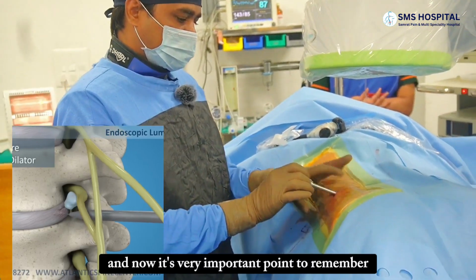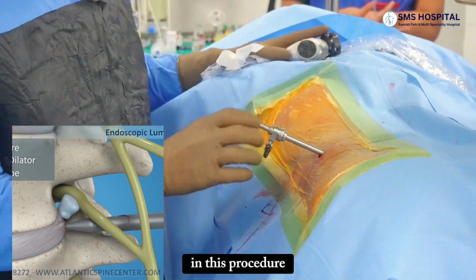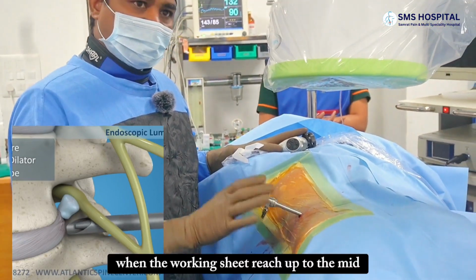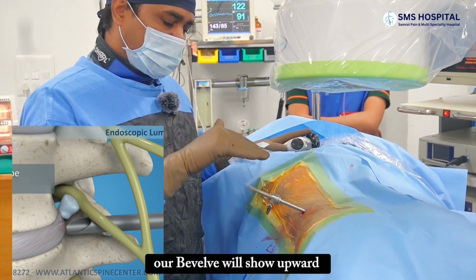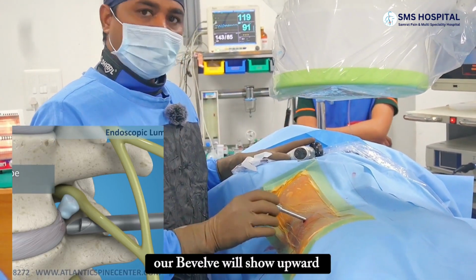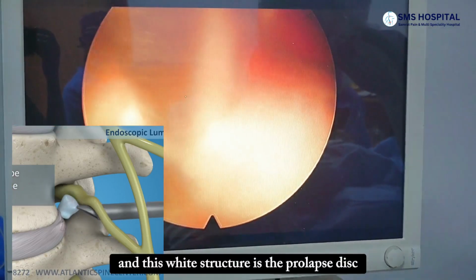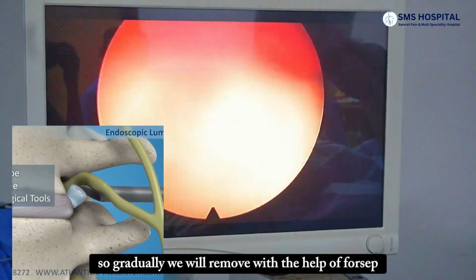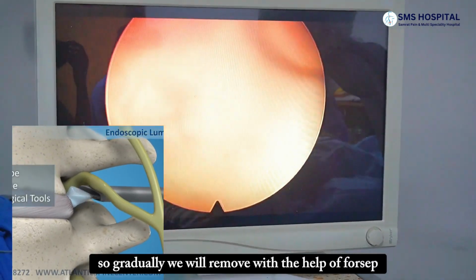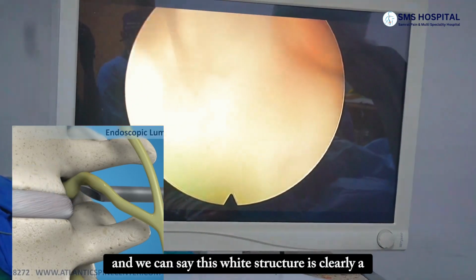And now, it's a very important point to remember in this procedure. When the working sheath reaches the mid-pedicular line, our bevel will show upward. There is slight bleeding, and this white structure is the prolapsed disc. So gradually we will remove it with the help of forceps.